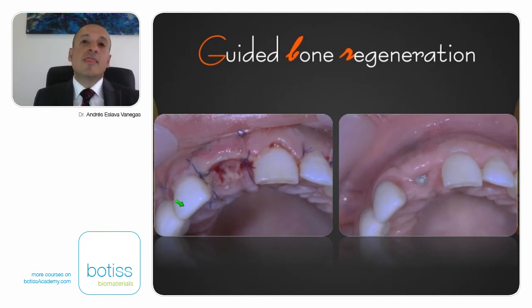Now you can see this 48 hours after the surgery. At the right side of the screen, here is 6 months later. You can see here there is maybe some retraction or some resorption of the bone graft. Just keep waiting. Remember the implant is located at the palatal side, okay, and it is just a healing abutment. We haven't done the profile of this tooth.